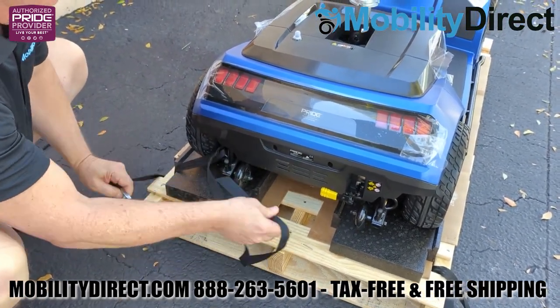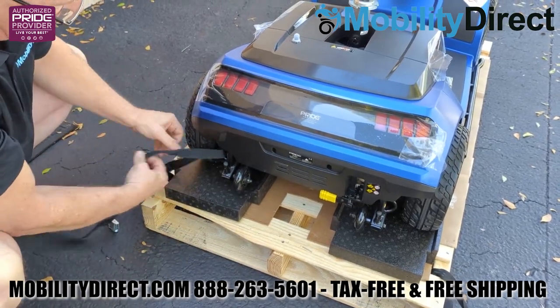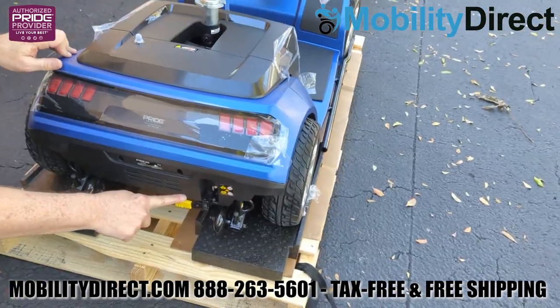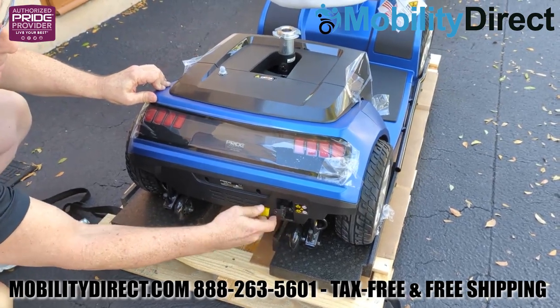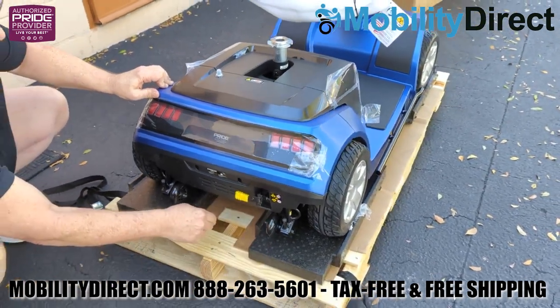The straps are fished through the docking station loops on the rear and the front of the frame as well. Go ahead and remove all four straps. The next thing you're going to want to do is disengage the automatic braking system by pulling the yellow lever upwards so that it's in the upward position in the N mode for neutral mode.